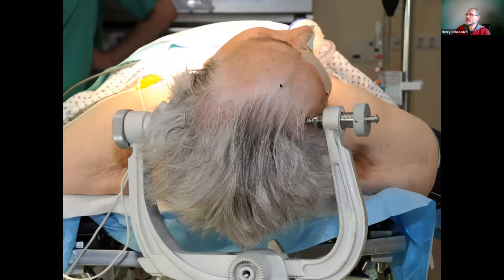And then we have a hyperextension of the head, so that the zygoma is the highest point. I think that is very important because you want the frontal lobe to fall back by gravity, not by retraction. And then we turn the head different degrees to the contralateral side, depending on the location of the lesion. If the lesion is more anteriorly located, like an olfactory groove meningioma, we rotate the head about 45 degrees. If the tumor is at the tuberculum sellae or the middle sphenoid wings, then we rotate less, that means 30 degrees or 25 degrees.